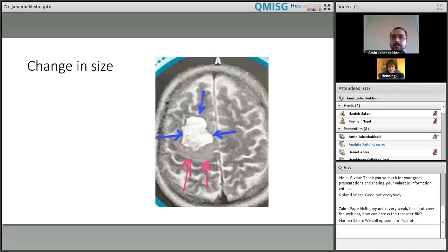It is very important for us to detect very little changes inside of tumors. In usual practice, we just see this lesion by eye, and we have to judge if there is tumor growth or not. But I think artificial intelligence could help us in this matter.